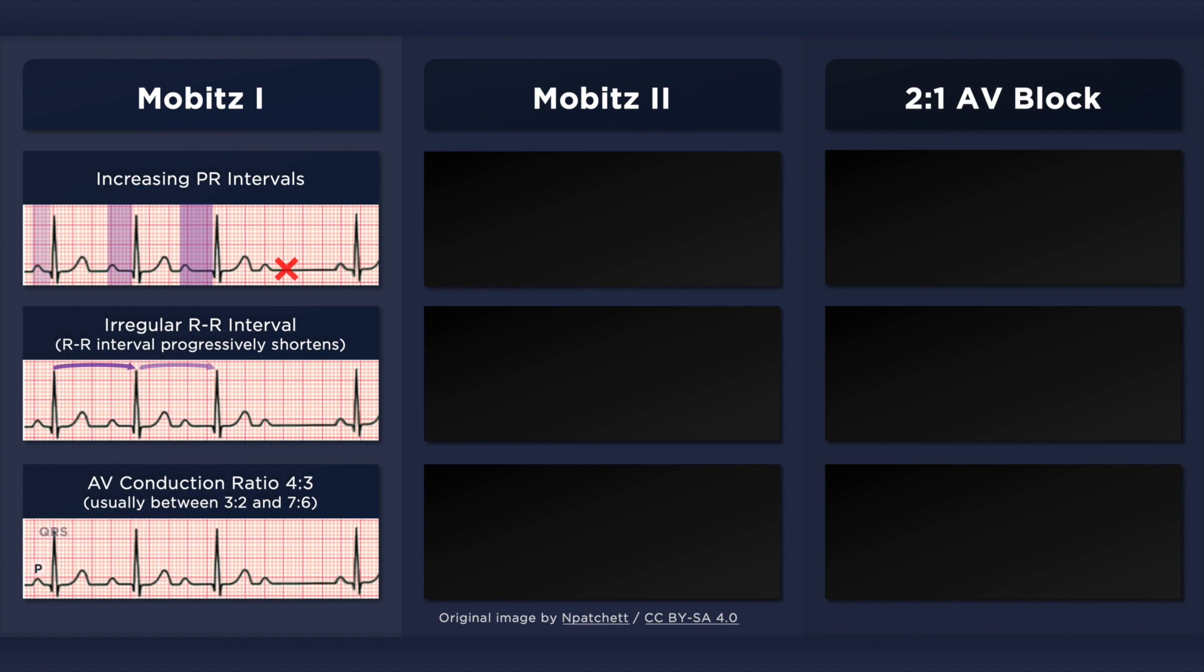In this example, the atrial to ventricular conduction ratio is 4:3. That is, for every 4 P waves, there are 3 QRS complexes.